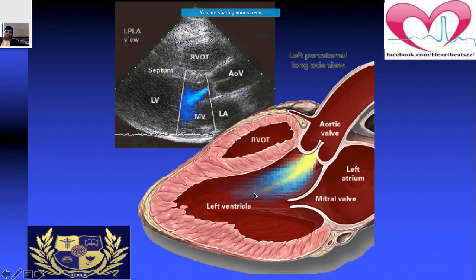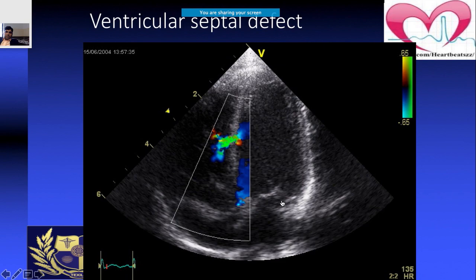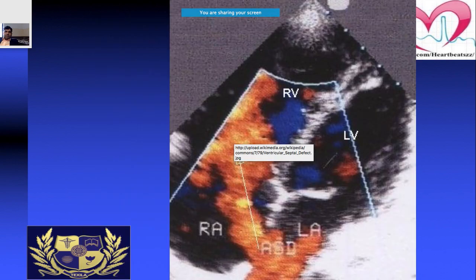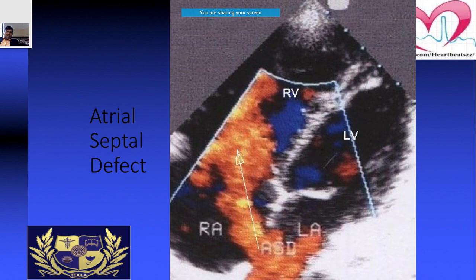This shows a ventricular septal defect with color Doppler, and in this next segment you can clearly see an atrial septal defect.